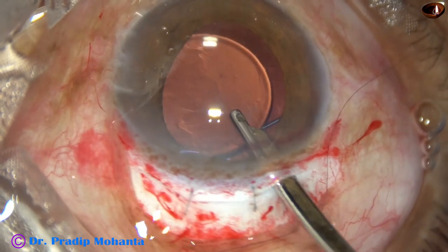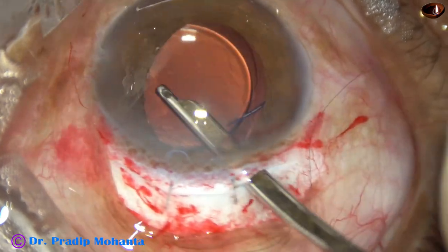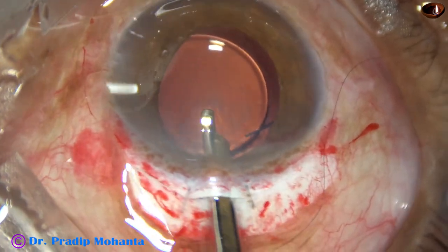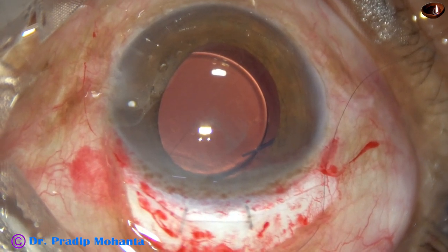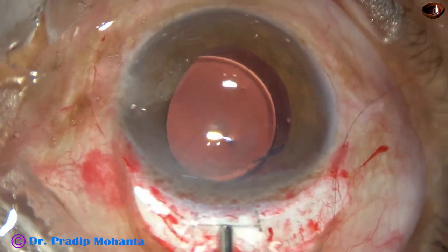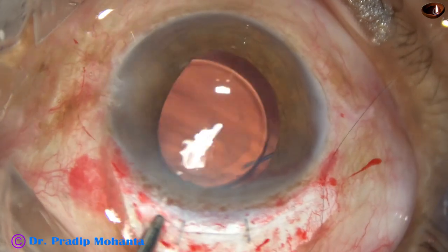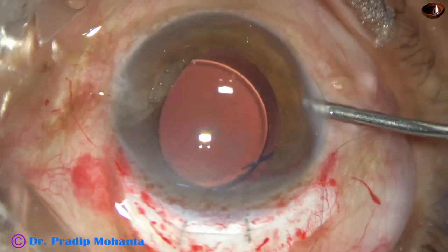The anterior chamber is irrigated and then the capsular bag is irrigated. Irrigation means some BSS is taken in a 10 cc syringe. Irrigation is already there and through the aspirating port the BSS is flushed. So there is irrigation through two ports. Through the aspiration port also there is irrigation, and because it is attached to a bottle, there is already irrigation. And this is the irrigating probe of bimanual IA. Did some more irrigation to remove all the viscoelastic substance.